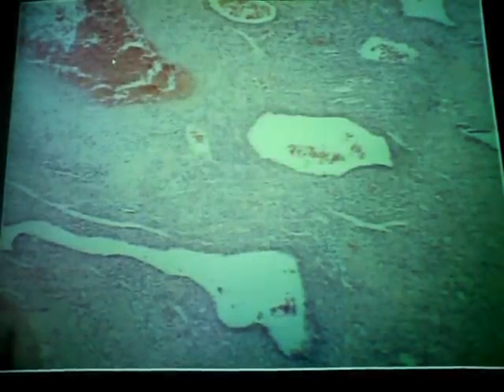And more of the same. Blood vessels, you can see the tissue's all torn up. So this is basically, the lining is eroded, it's degenerated, and it's being sloughed off. So much of the endometrium is gone. What's left, okay, down here is a little bit of the basal layer, stratum basalis. And then right away, we go into the myometrium here, which of course remains intact.